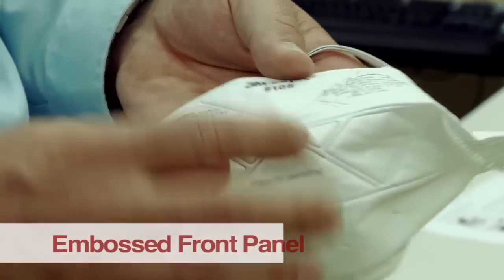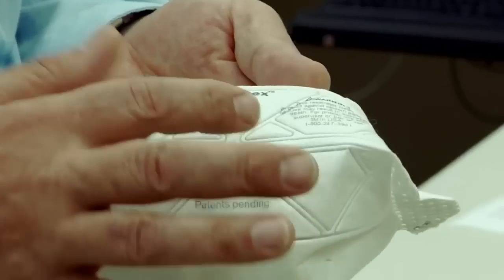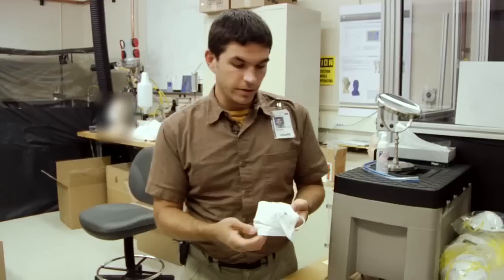We've incorporated these embossed patterns on the front of the product. If we didn't have these here, as the person breathed, you would potentially have this product coming in like this and touching the lips.